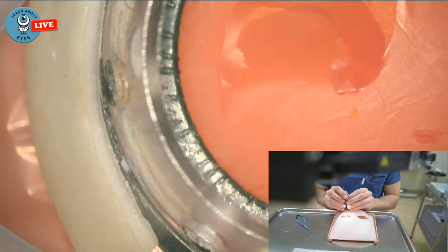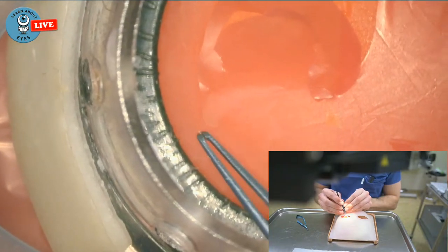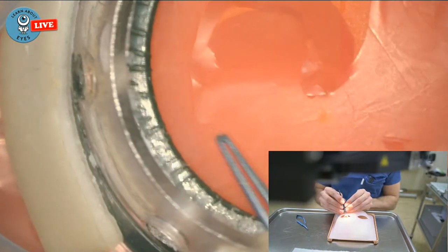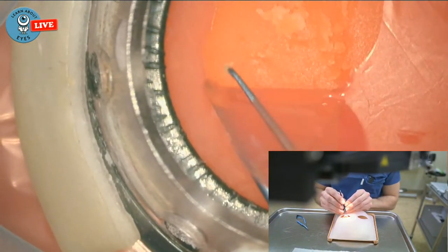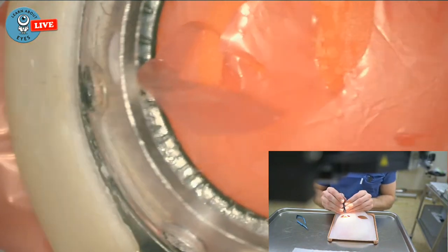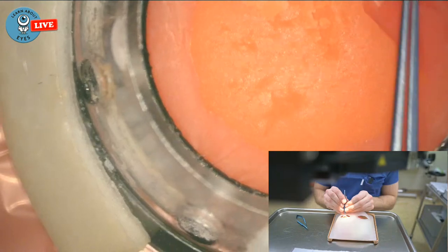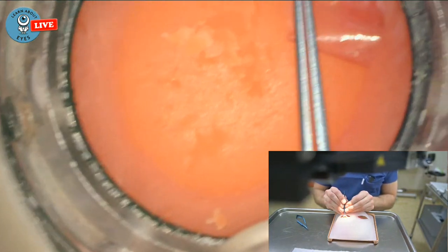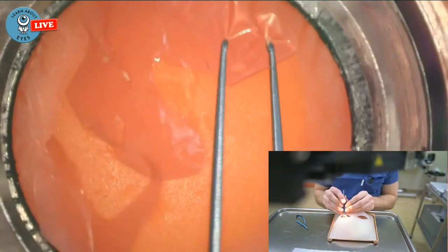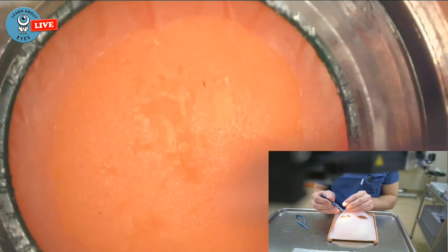Okay, so can you see after I have pulled it back that the vector, or the rib that was going this way to go out here, is now going in again. So at this point, I can take it back and pull it back like normal. This is a bit too close for me. I have a really magnified version. Now it wants to kind of run out again. Grab it, pull it a little bit back, and then you should go like that.